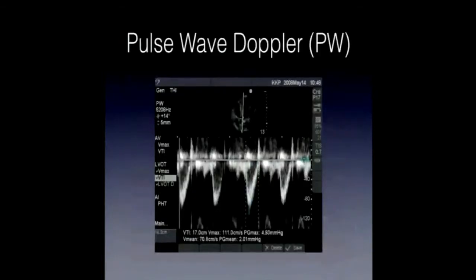And so this is a typical pulse wave Doppler image. You'll note that it's more of an outline now. The middle section of the graph is missing. It's black, and there's only what we call a modal velocity, because it's only measuring at a certain point. Here's what you can't see very well, but there's a little gate here at the aortic valve, and we're measuring that point only. So we're not picking up all the slower velocities as the blood accelerates faster towards that LVOT, and that's why it's not filled in.